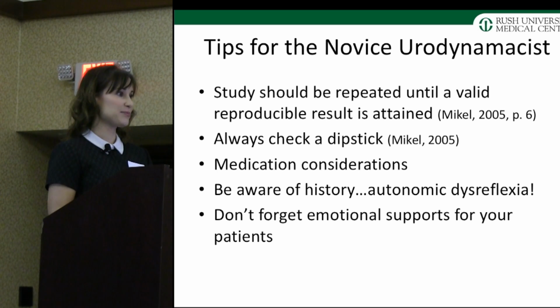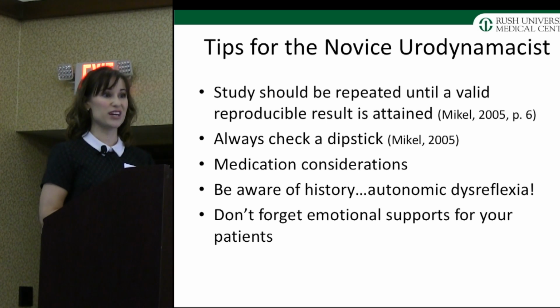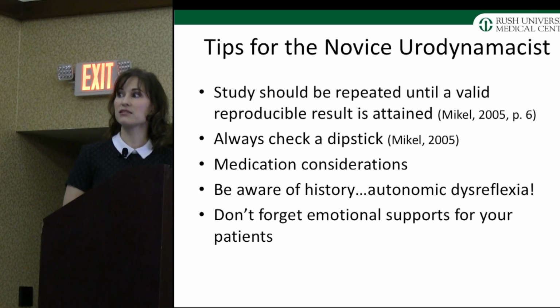You always want to check a dipstick first, just to screen for infection. If they do have an active urinary tract infection, you don't want to do that urodynamic study because you run the risk of introducing bacteria into the bloodstream, causing sepsis.